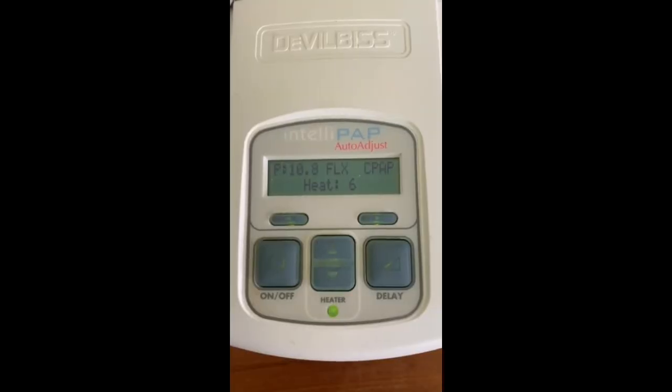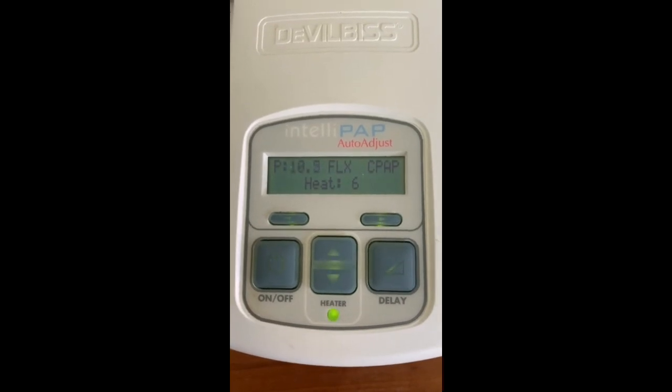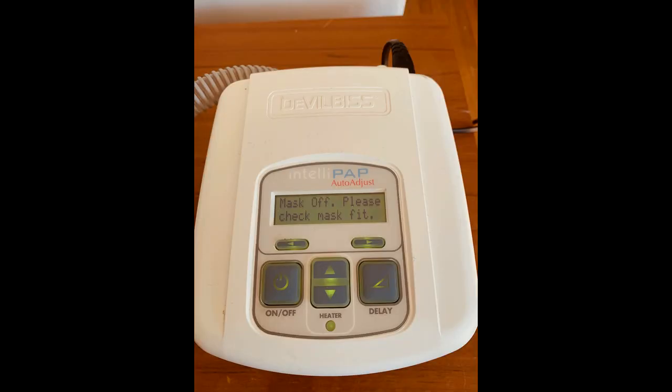Notice when I inhale the pressure goes to 11, and when I exhale to 8 centimeters of water. This is normal function for my machine which has CPAP flex. It functions sort of as a BiPAP with higher pressures for inspiration — in my case 11 — and lower pressures for expiration — in my case set to 8.